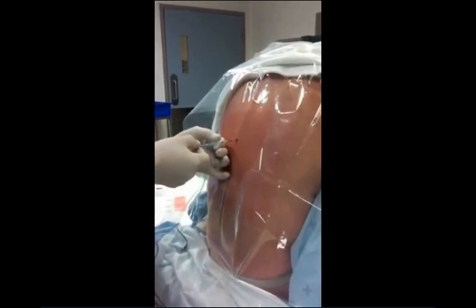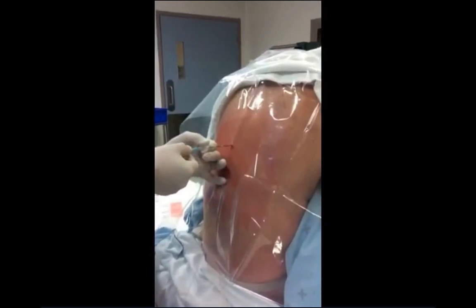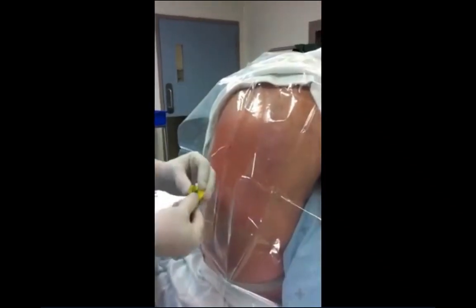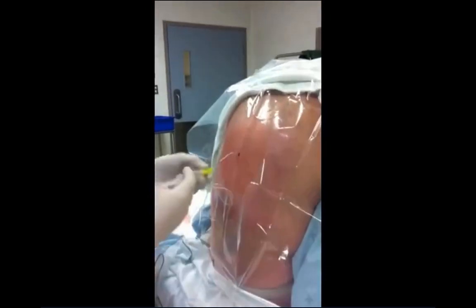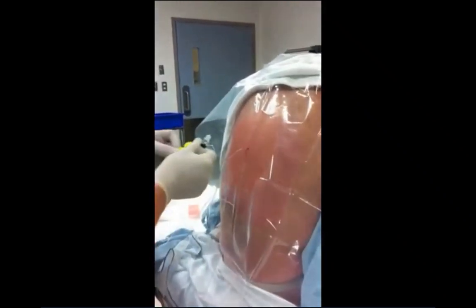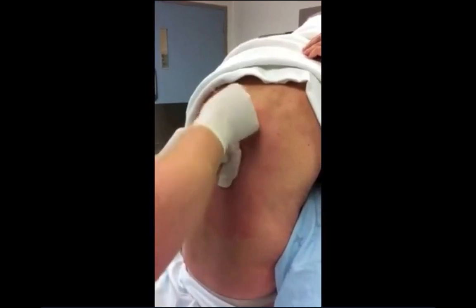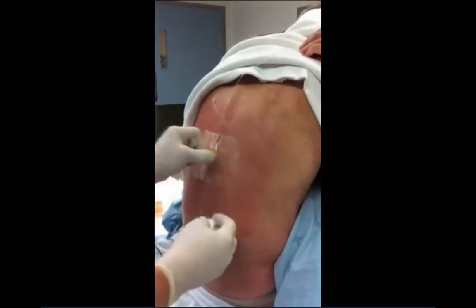The catheter is placed into the epidural space and the epidural needle is removed by backing the needle out over the catheter, ensuring the catheter stays in place. The catheter is secured at a depth of 10 cm from the level of the skin such that the catheter is left inside the epidural space approximately 5 cm. A syringe is attached and negative pressure is used to confirm that the catheter has not entered a blood vessel or the CSF space. 3 ml of 1.5% lidocaine with epinephrine is administered to test the placement of the catheter. The catheter is secured using a sterile occlusive dressing, and a dilute solution of bupivacaine with fentanyl and epinephrine was used to establish the epidural block.